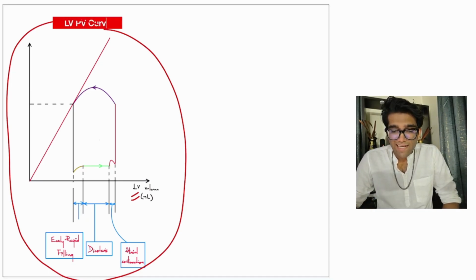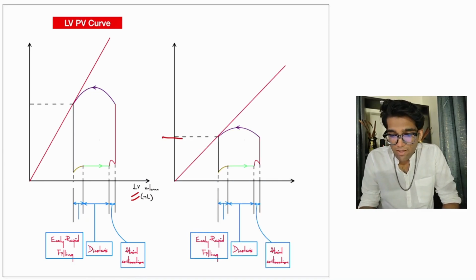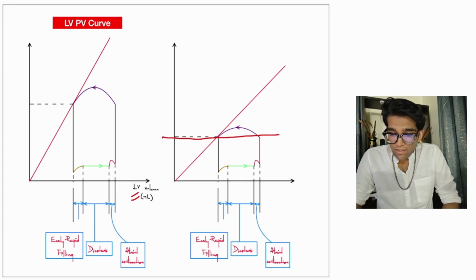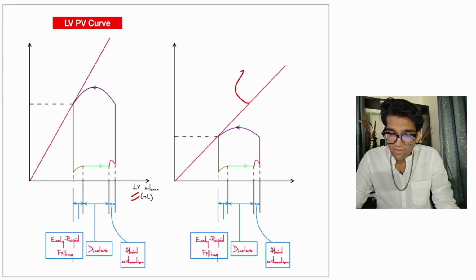So what does it look like? It looks like this. So as you can see, obviously the RV mass, the pressures that it reaches are much lower than that in the LV. Okay, even this is not to scale. Otherwise, the graph is very similar. Because of that, this was the slope.